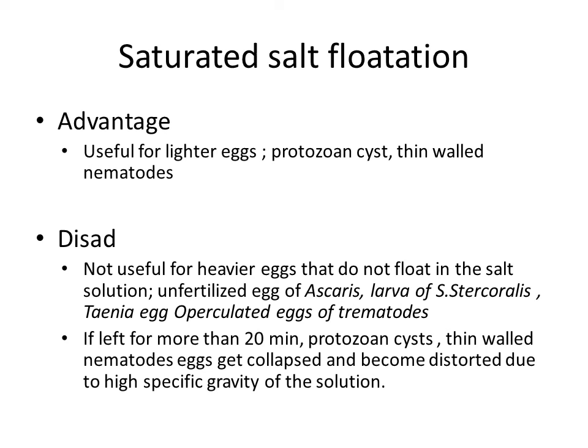We are using a high specific gravity solution compared with the parasitic stages. This solution affects the trophozoites, cysts and nematode eggs, so it damages the parasitic stages. So we have to observe within 20 minutes.